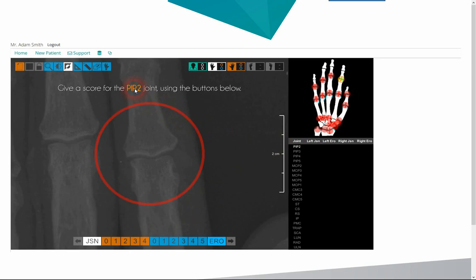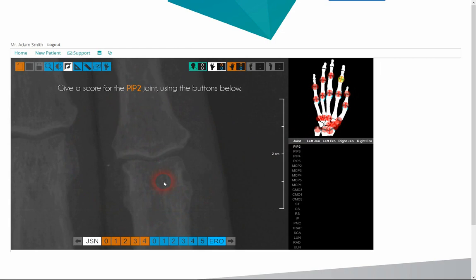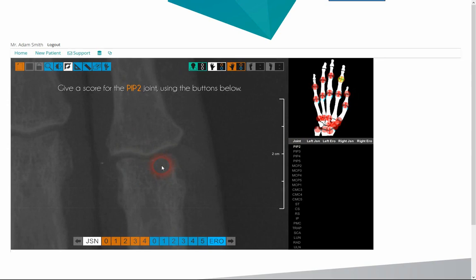The first joint to evaluate is the PIP2. To help the evaluation, we can zoom in, fine tune position, and change brightness and contrast. For the exact measurement of joint narrowing, a tool is available.